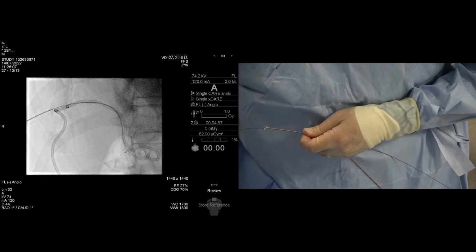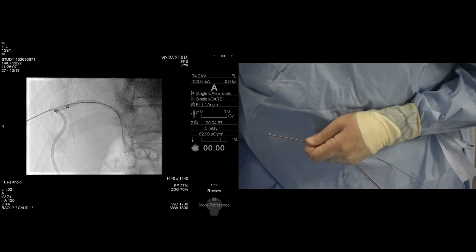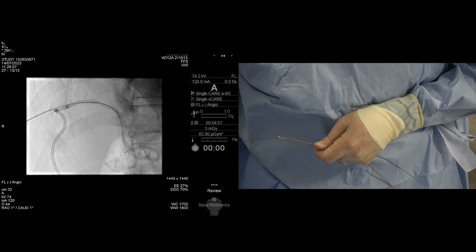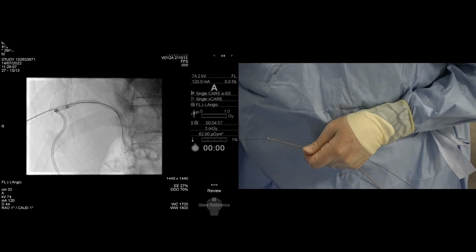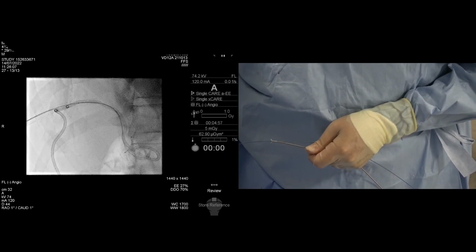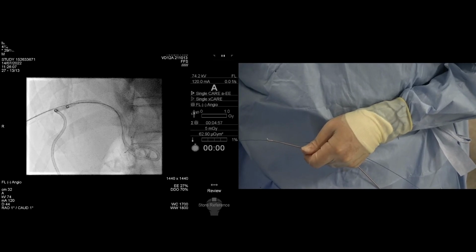Whatever technique you use to make a histological diagnosis, whether it's a surgical resection or an endoscopic biopsy, the bigger the tissue, the more likely you are to make that diagnosis. And that's particularly true within the biliary tree. We have over the years used fluoroscopically directed endobiliary biopsies, so essentially putting standard biopsy forceps up the bile duct. That is technically challenging often, particularly passing biopsy forceps out of the bridge of the duodenoscope and then through the ampulla. That can be challenging, and there is a definite concern and a risk of trauma, including bile duct perforation.